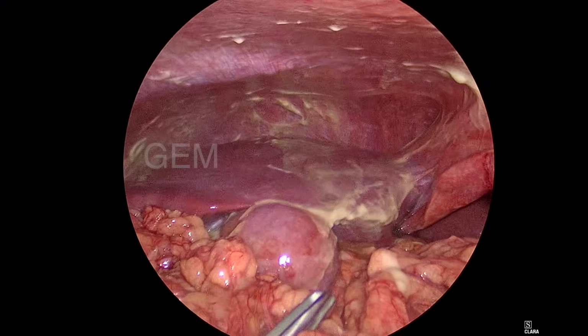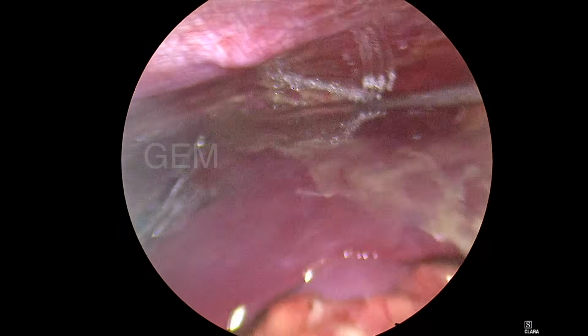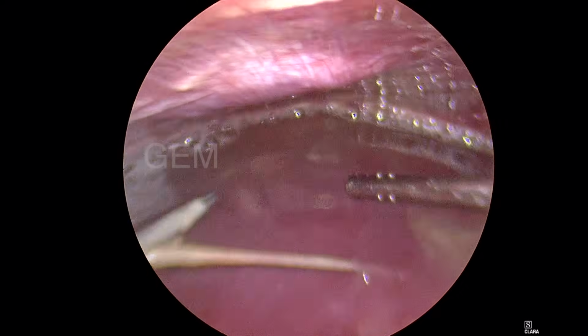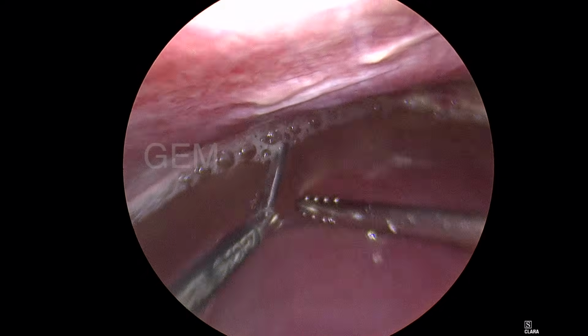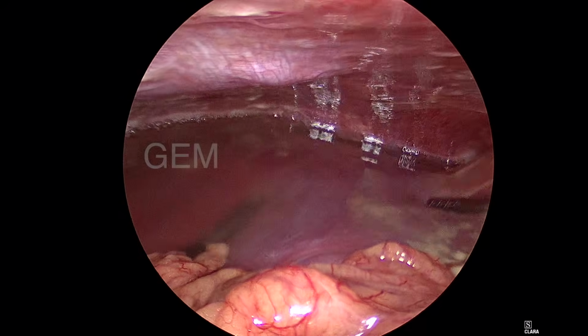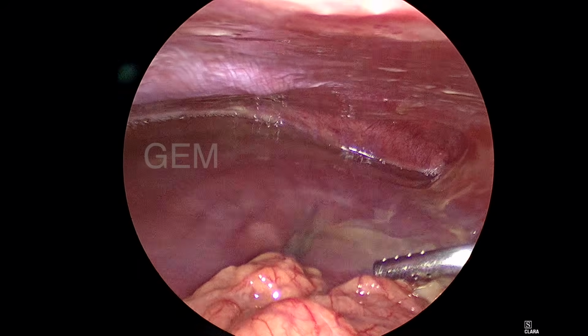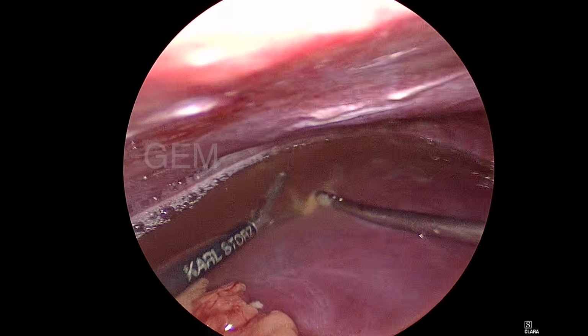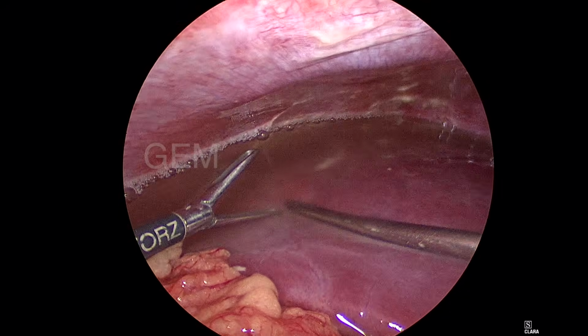I am trying to take this omental plaque. At the end of the surgery, almost the entire plaque will be removed through the suction only. Once it is removed, you can suck it out. No need to take it through the instrument port. So it is being sucked out.